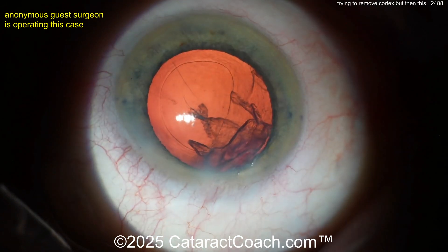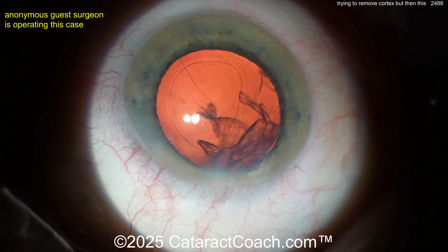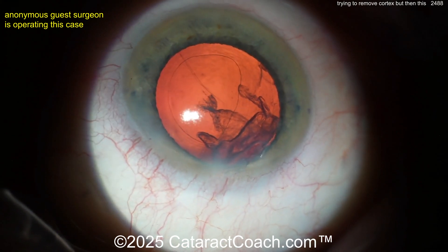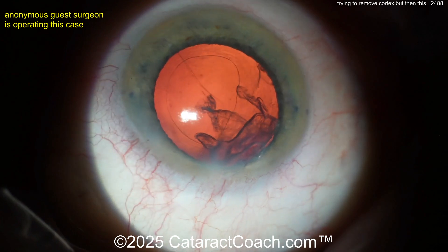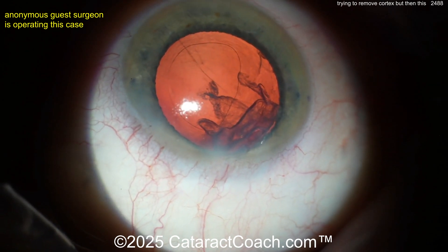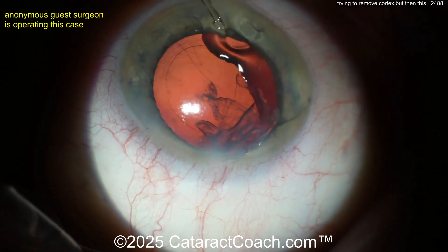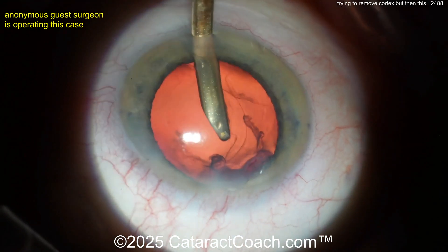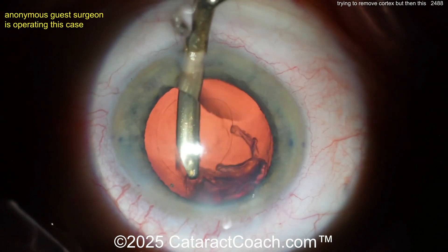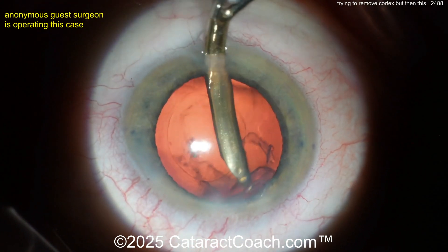Here comes another incision. This is interesting — it's opposite the surgeon, who seems to be sitting superiorly, and that was an inferior incision for the patient. Look at that rhexis: it's shifted over because there's a lot of zonulopathy. That oval-shaped rhexis shifted — it was round initially. What do you want to do here? Probably a Simcoe is not your friend here, not really what you need, because there's still no counter-traction.